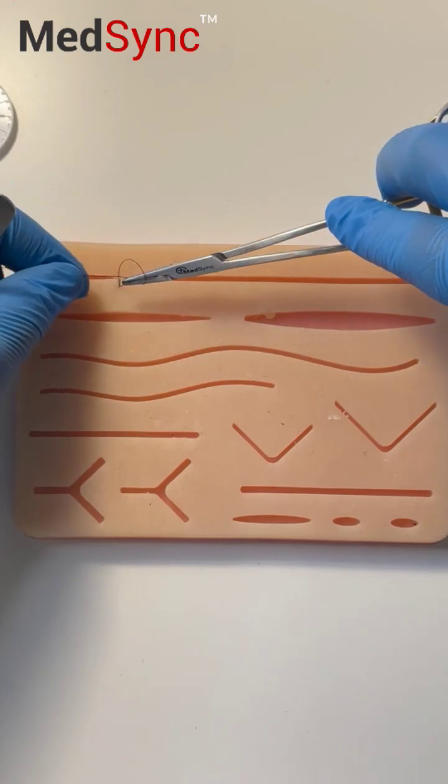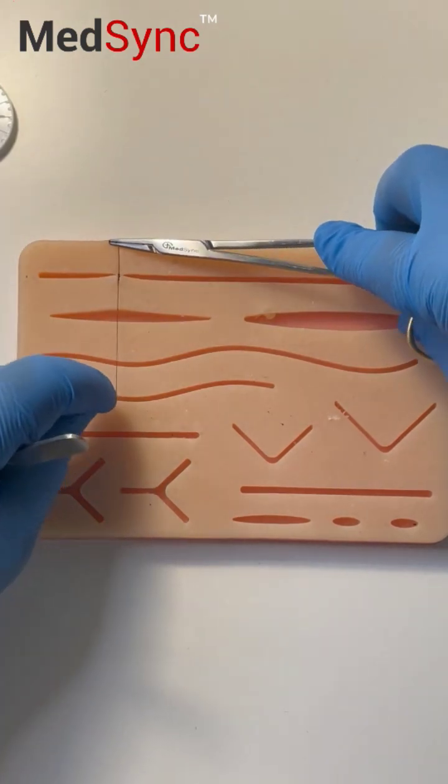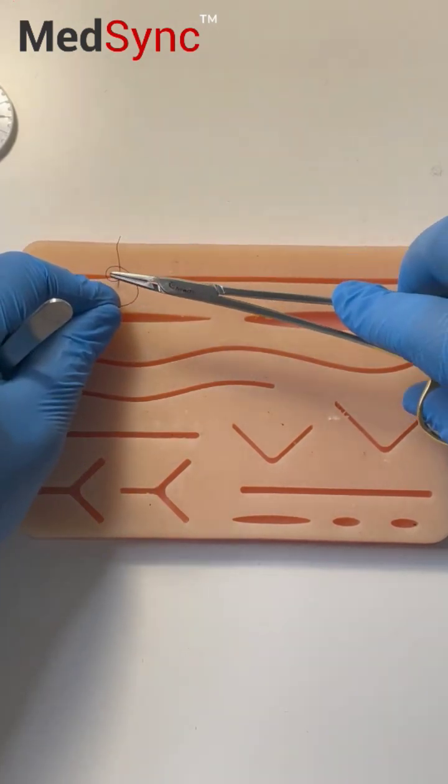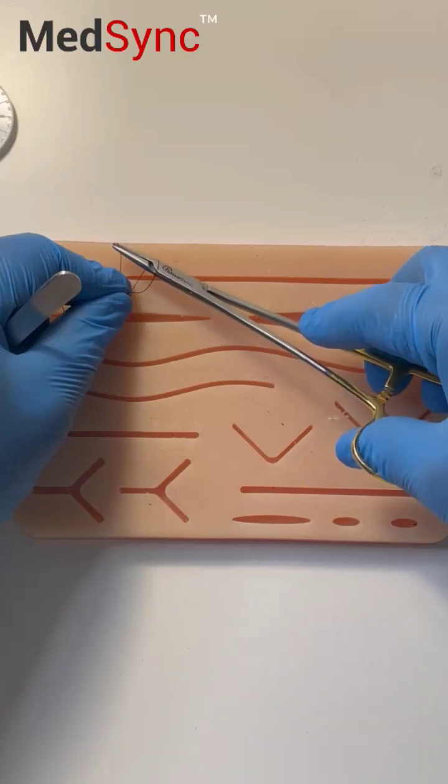Grab the short end at the tip and alternate. Push it forward. It creates the loop and tie.